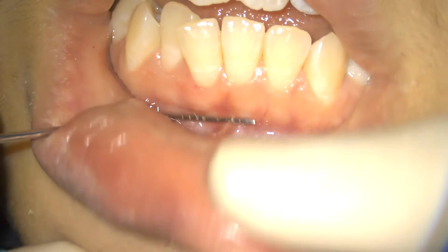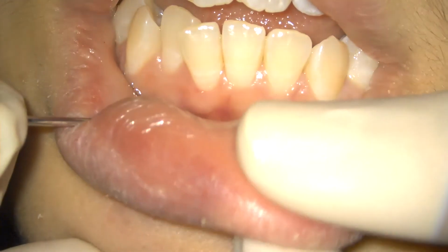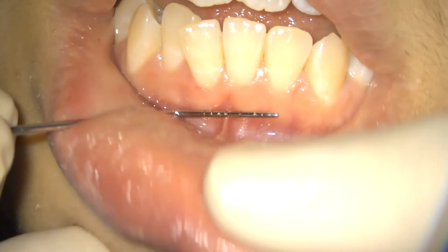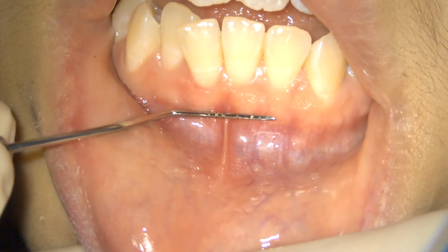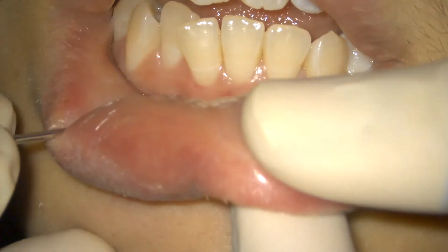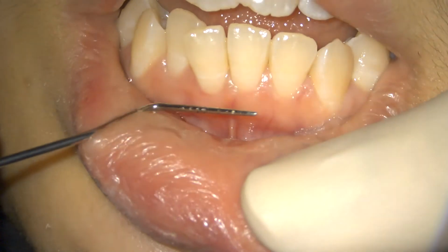But in this case, if you see, there is enough attached gingiva, so adequacy is present. Even when the lip is being rolled, the probe is not being pushed, because it will stop. The attached gingiva will act as a barrier and stop movement of the probe beyond this point. Okay, so this is how you assess the roll technique.